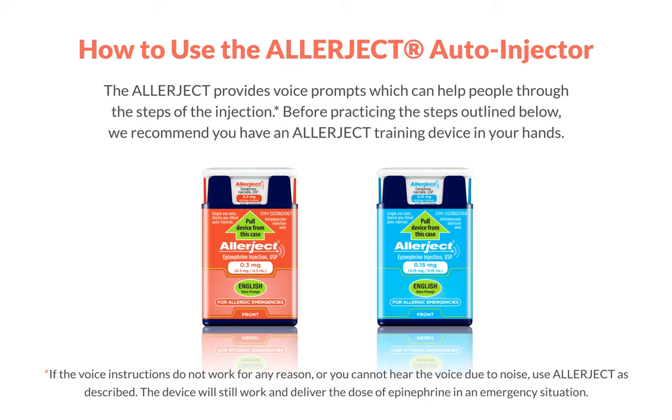Now let's walk through how to use the Allerject auto-injector. Please follow along with the appropriate training device. Please repeat as necessary until you feel confident with how to use the Allerject.